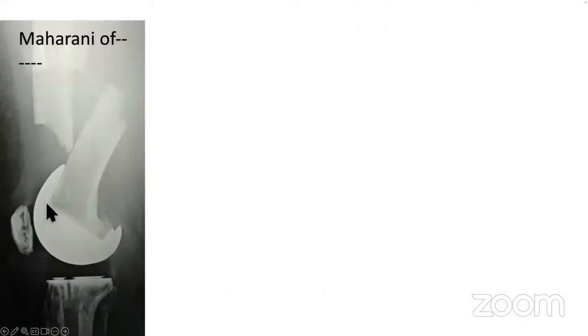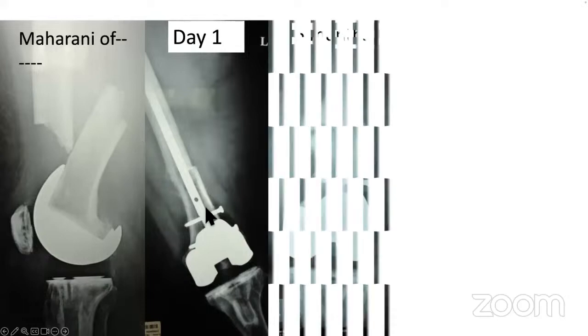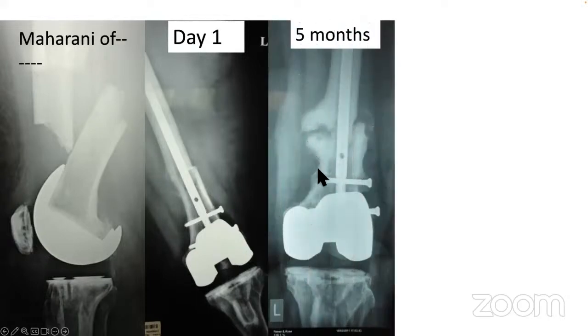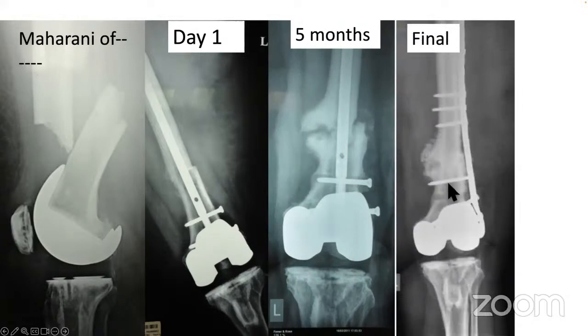Same thing here, you can see. The same surgeon treated this patient for the fracture. He did the nailing, but you can see there is hardly any callus formation there. So he did the nailing, it went to a massive non-union at 5 months, and I treated it with compression and grafting. But on day one, if after the nailing he had put in the plate, probably the whole thing could have been fully avoided. So this is not a good fixation.